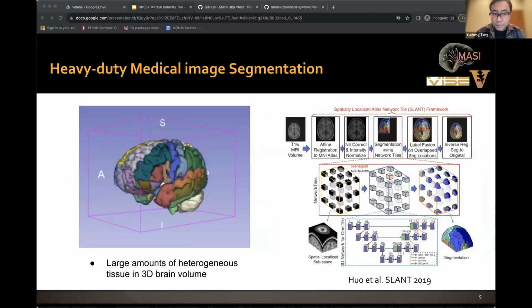One of the primary challenges lies in the sheer scale of this problem. With more than 130 classes to delineate across the entire human brain, the model must contend with a colossal amount of data and information. This complexity makes it an incredible challenge for traditional deep learning or machine learning models to learn or accurately represent the intrinsic and interconnected structures within the brain.